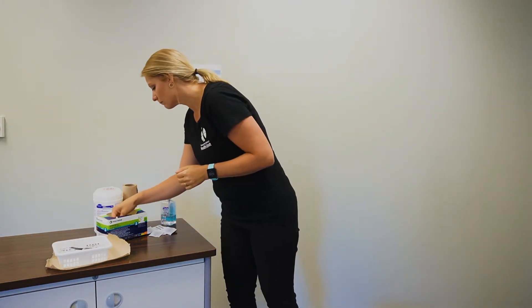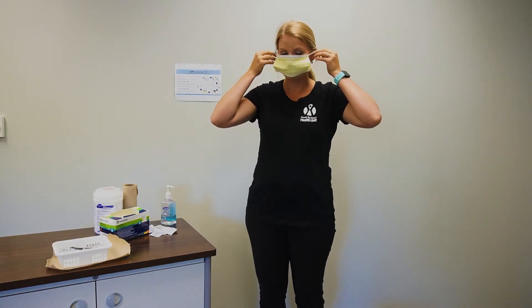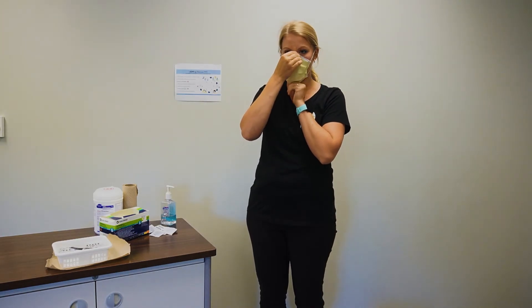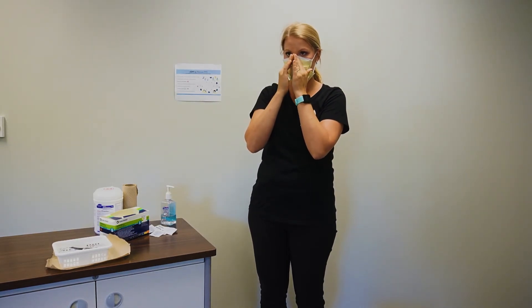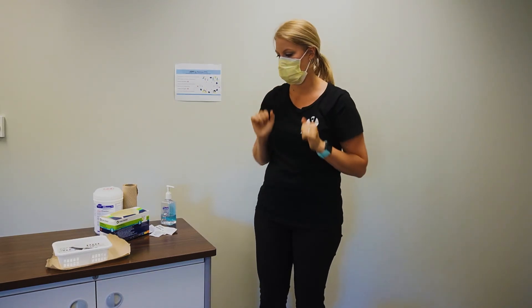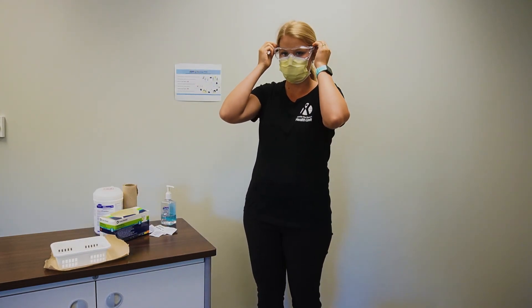Put on a clean mask. Press the metal piece with both hands to form around your nose. Replace with clean eye protection.